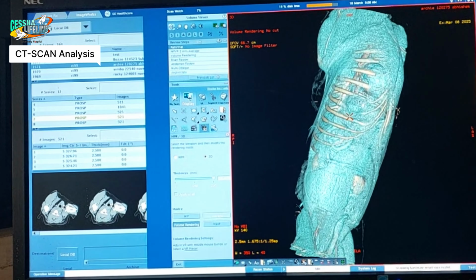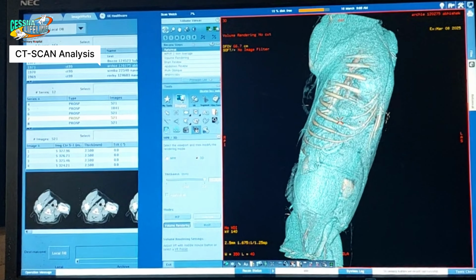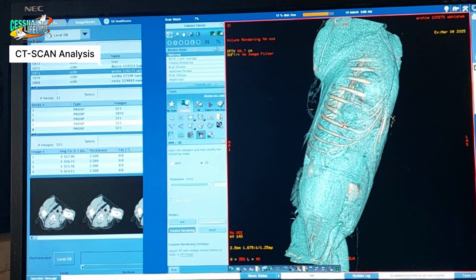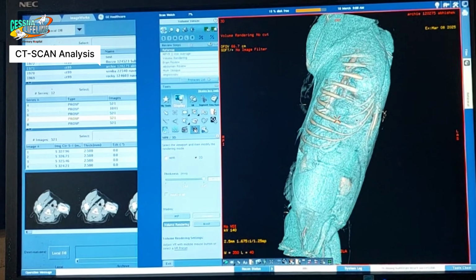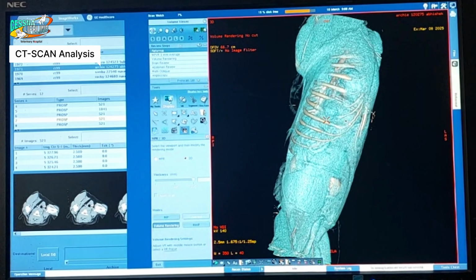the osteochondral junction. We have done a fine needle aspiration for this, and we found that this is a sarcoma, and to me it looks more like a chondrosarcoma, but it can be osteosarcoma also. Once we remove it, we are going to send it for biopsies.